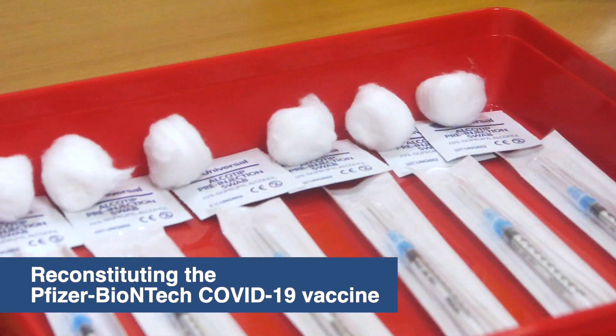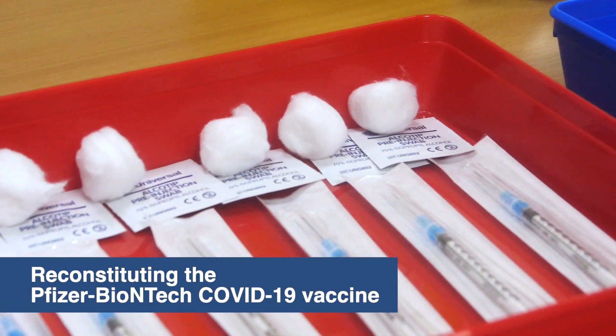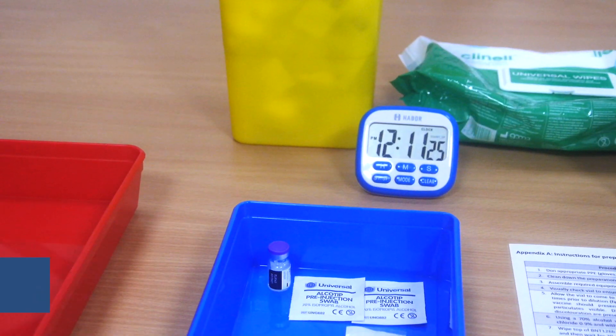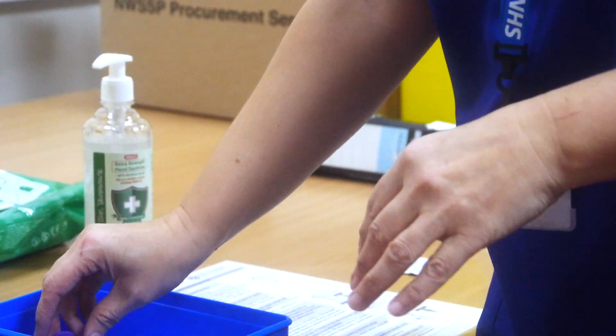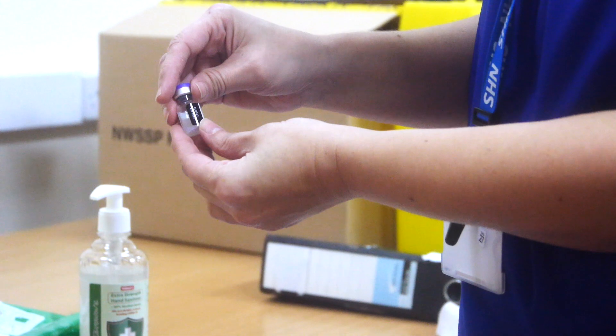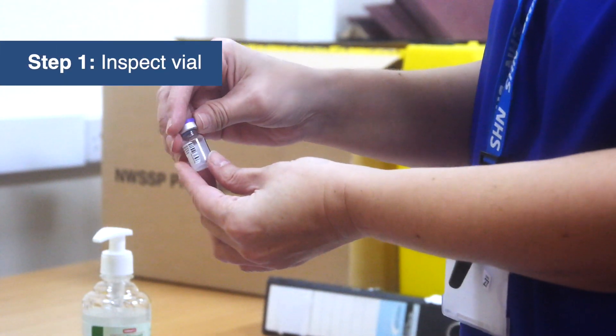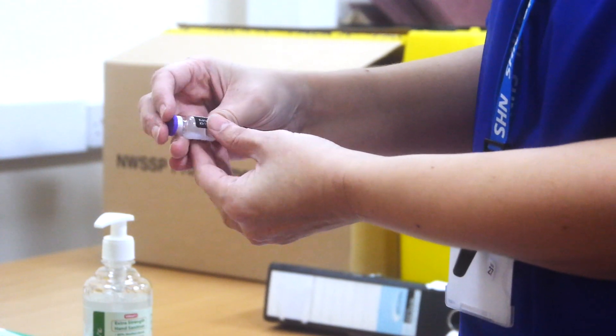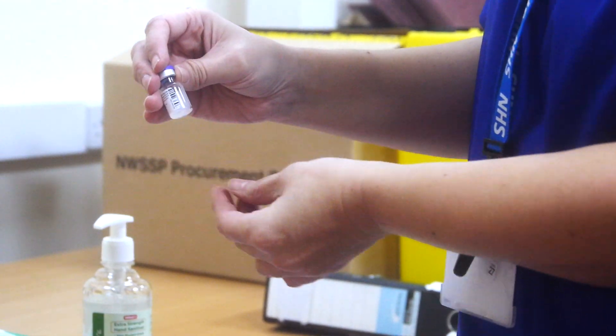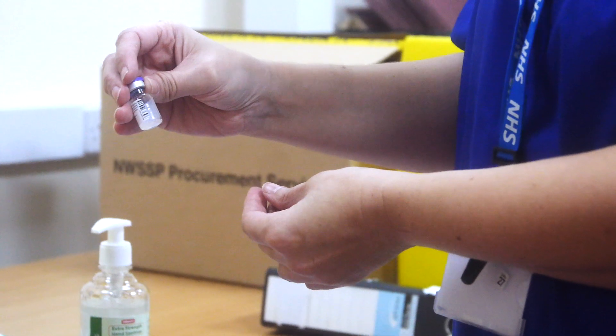These are the steps you need to take in order to reconstitute the Pfizer-BioNTech COVID-19 vaccination. Having received the vaccine, you need to inspect it first by checking the batch number and the expiry date. When you receive the vaccine from the fridge, it will need around about 10 minutes to come to room temperature.